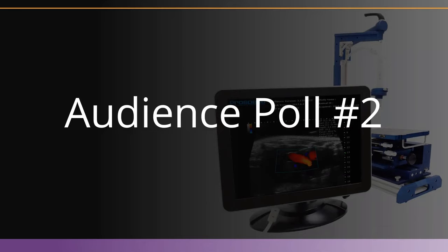Okay, so poll number 2, this will be quick. We would like to know, just based on the add-ons that Tanya mentioned moments ago, are you interested in learning more about any of the specific add-ons or imaging modes discussed? And if you could just select any or all of the following. So if you'd like to learn more about 3D imaging, select the first option, image-guided injections, shear wave elastography, sonoporation, or even just the basic imaging capabilities of the system. So with that said, Tanya, I'll let you monitor the poll's progress and then you can continue when ready.